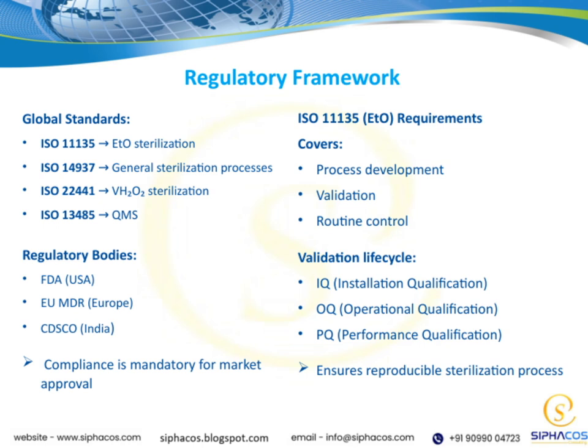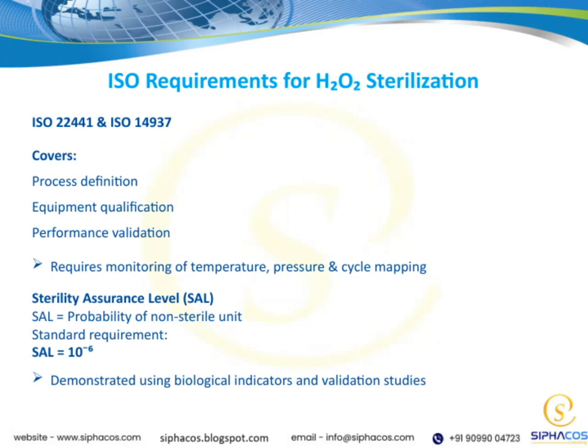These standards are supported by regulatory bodies around the world, such as the FDA in the United States, the EU Medical Device Regulation in Europe, and CDSCO in India. It's important to remember that compliance with these standards and regulations is mandatory if you want your medical devices to be approved and marketed in these regions. Keeping up with these requirements ensures not only regulatory approval, but also the safety and efficacy of your sterilized products. Now, let's take a closer look at the ISO requirements for H2O2 sterilization.